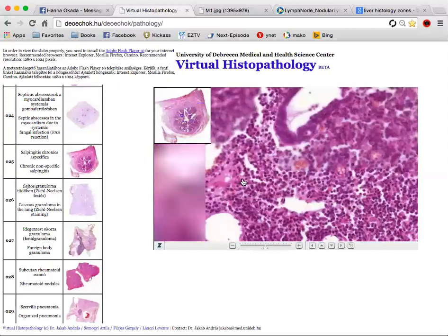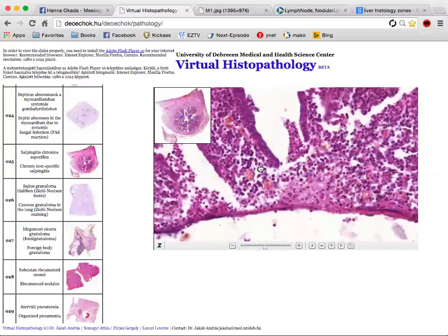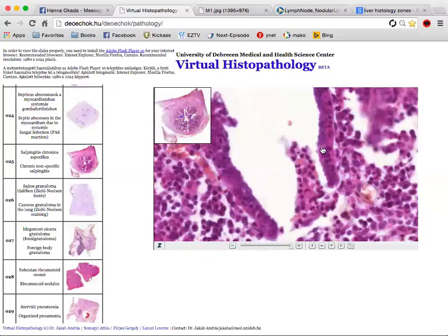Okay, so you don't have any of the normal tissue. You just have remnants. If you look here, this was an epithelium once upon a time, but right now it's dead. It's just disconnected. Okay. All right. Thank you.